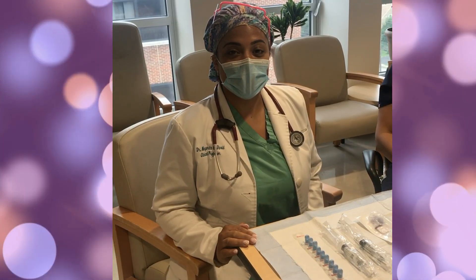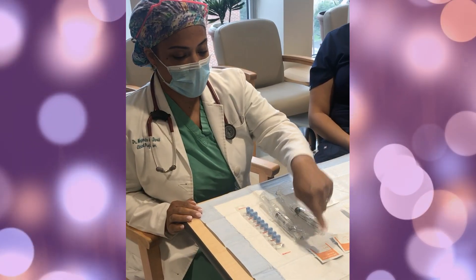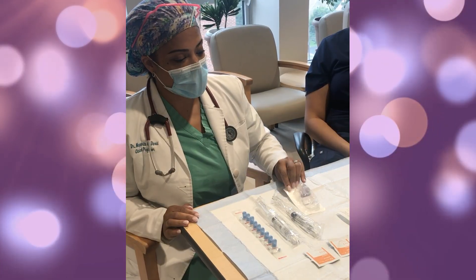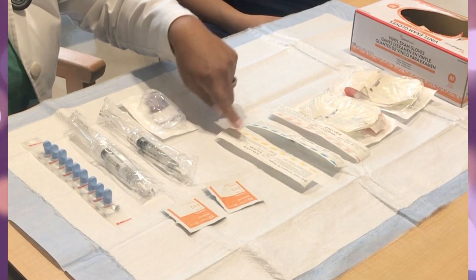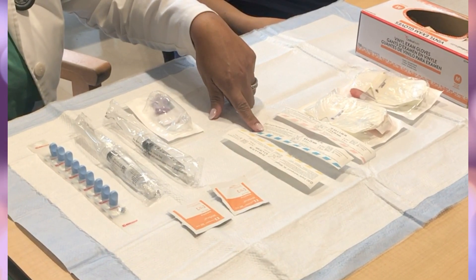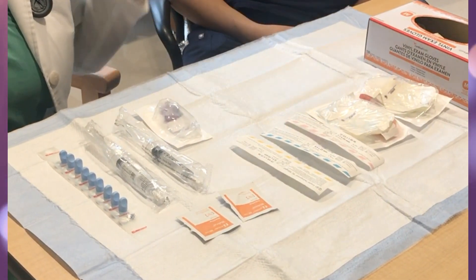Today we're going to learn how to insert an IV. First, you have a flush — I always bring an extra one — alcohol pads, caps to cover open ports, an IV extension, needles in different sizes: a 24 gauge, a 22 gauge, and a 20 gauge, depending on what your patient is going to have infused, as well as an IV start kit and your gloves, after you wash your hands.